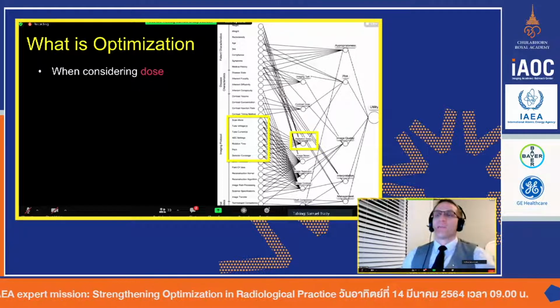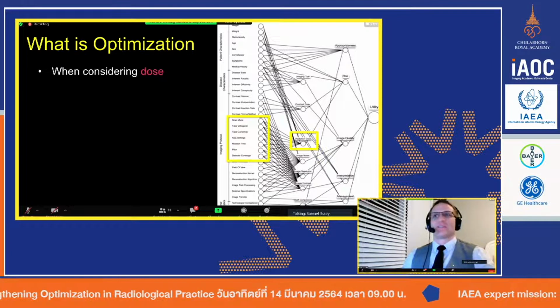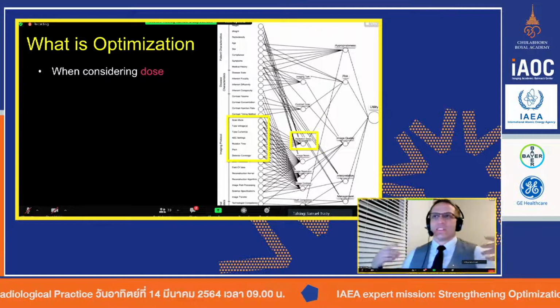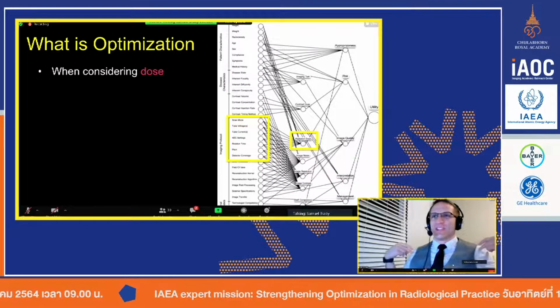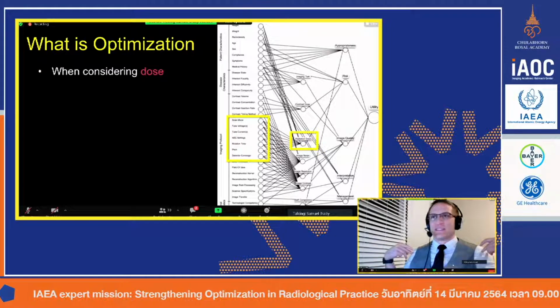Probably the most tricky, and now that I think about it, I probably should have included a slide on it, is the neck. And that's because if we're doing C-spine imaging, well, C7, it's actually down here. And so there's a lot of shoulder involvement when you're trying to image C6, C7.